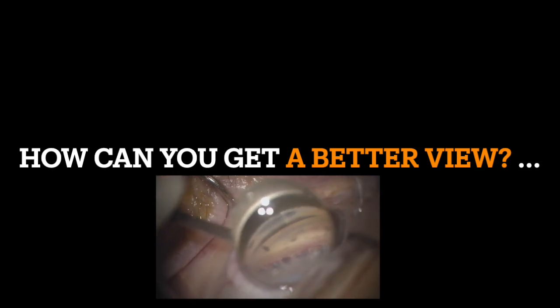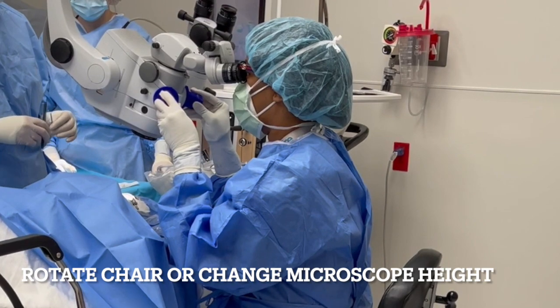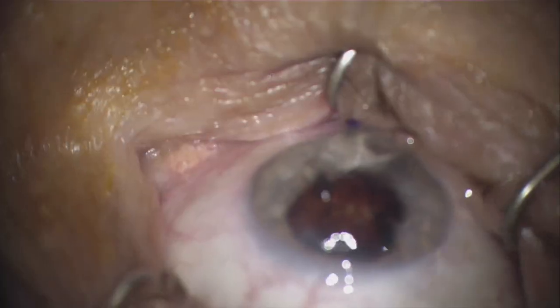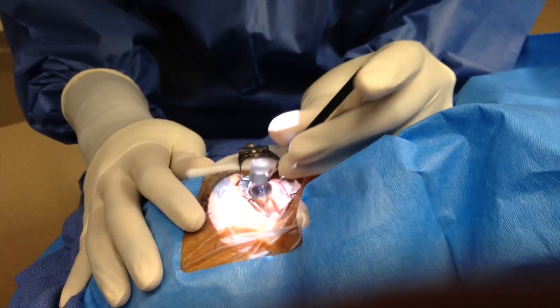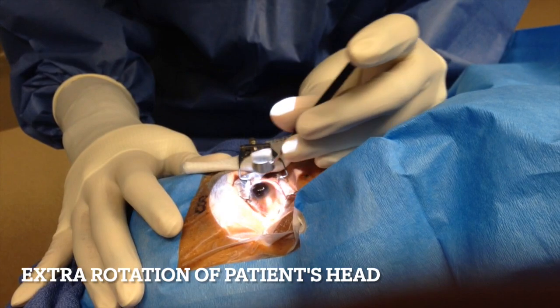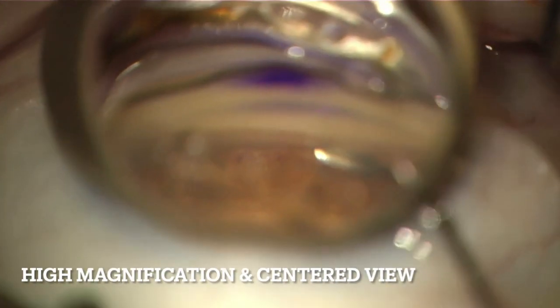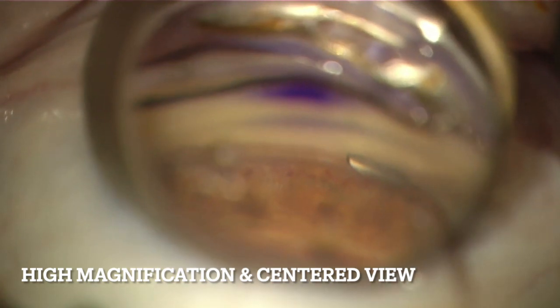How can you get a better view? For this procedure, it may mean rotating your chair slightly or changing the height, maybe shifting your microscope to set yourself up ergonomically. It may mean rotating the patient's head more, or having them look in a certain direction by your command and holding it there. Also, you should magnify your view so the speculum is not seen and you have a clear view through the center of the gonial prism.